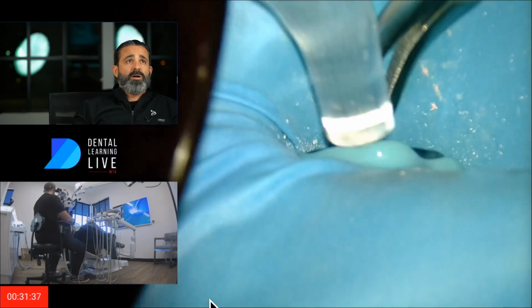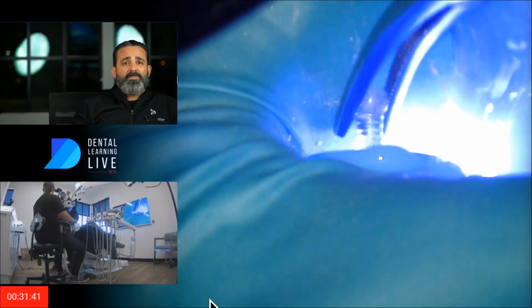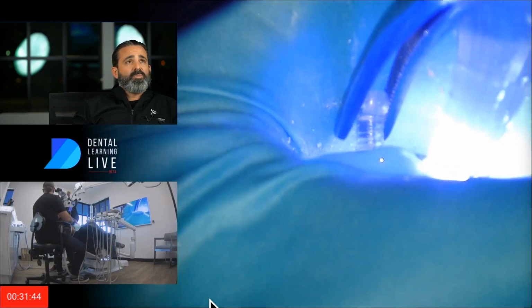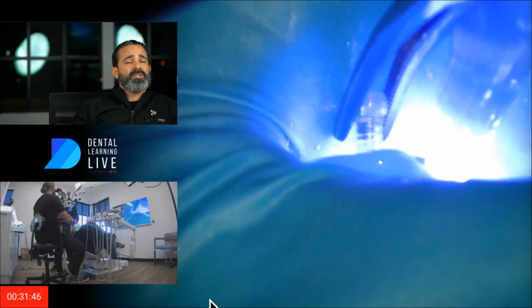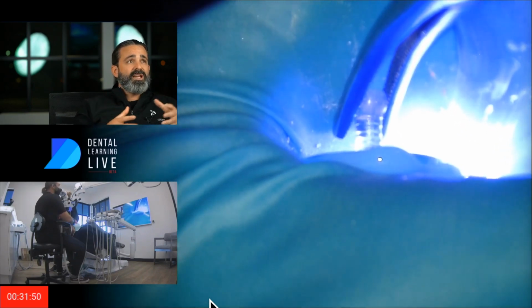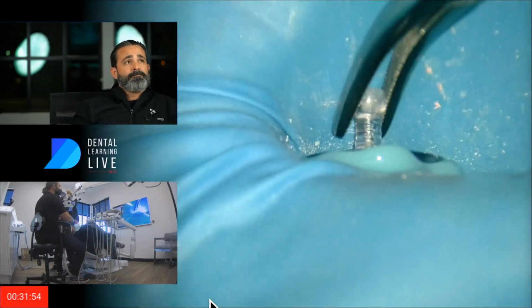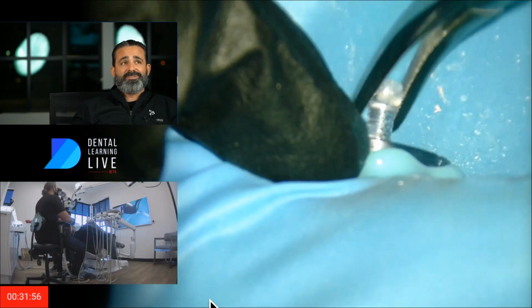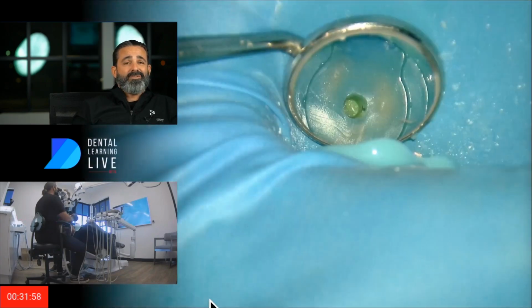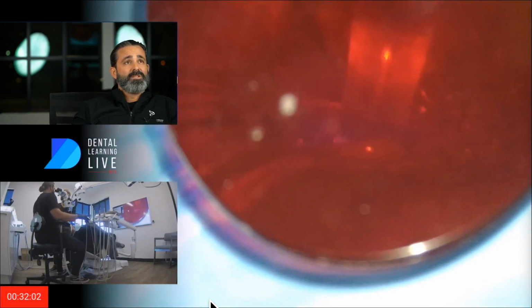So if the storm comes, meaning patient movement or clamp slipping or whatever it may be, I want to sort of prepare for it as I go into the case. And that's my logic as to why I really create a stable sound seal platform. Very important to me. Because when you start doing hundreds of these, man, it's not fun to rebuild. I hate it actually. So I just want to build one time.